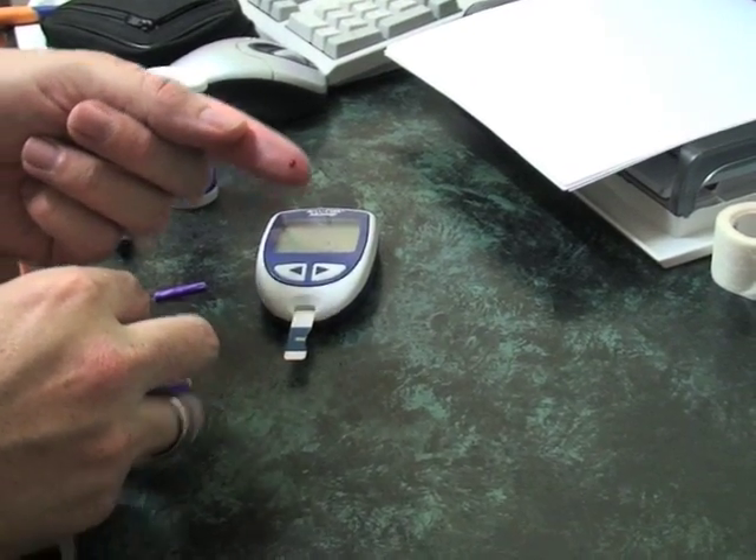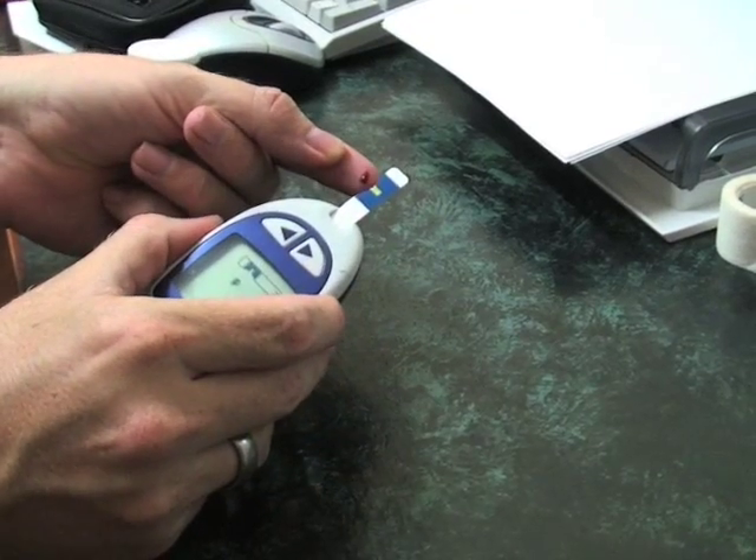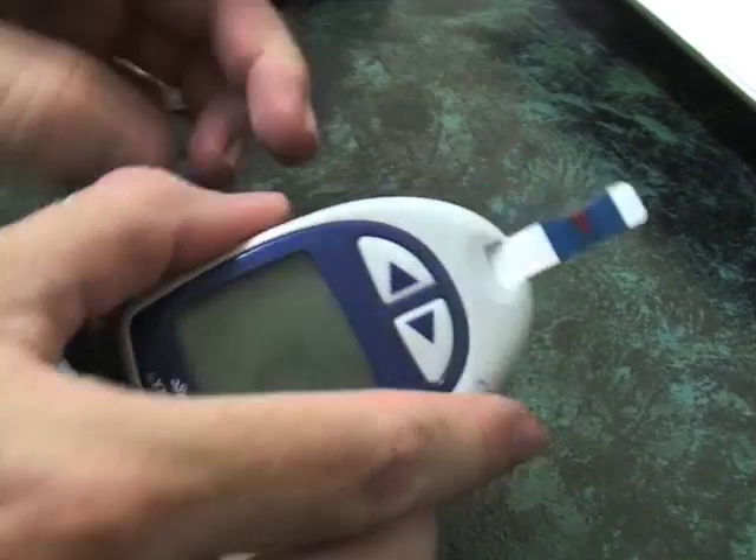You'll see there's already a small drop of blood. Give it a bit of a squeeze and you'll see that I'm getting the blood, and popping it just there, and it goes into the meter.